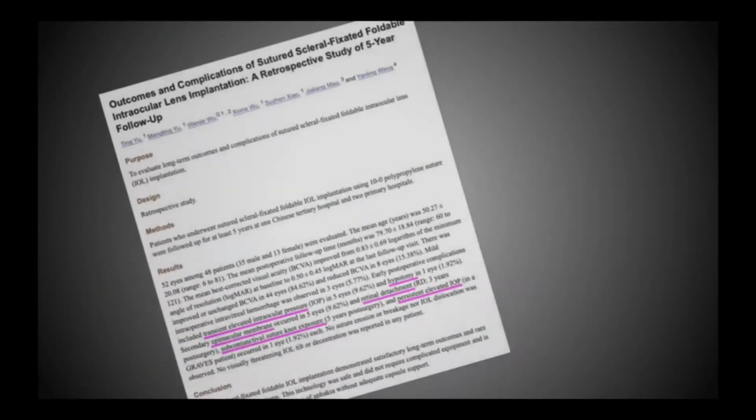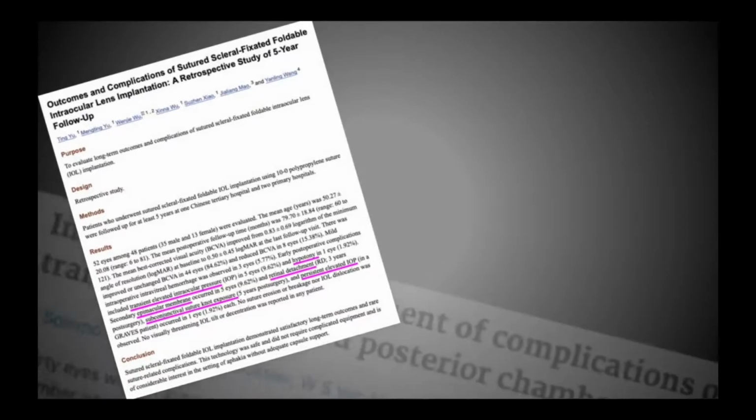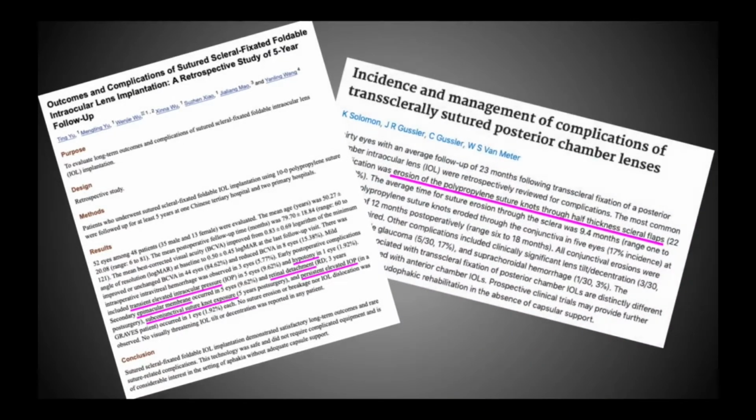On the other hand, sclera fixated intraocular lens is more challenging, especially for the young ophthalmologists. Various complications that arise from the sclera fixated intraocular lens can be a discouraging factor for the young ophthalmologist who wishes to proceed.